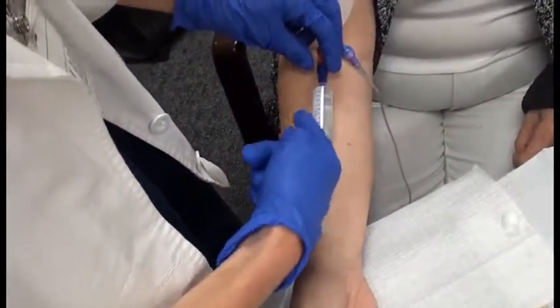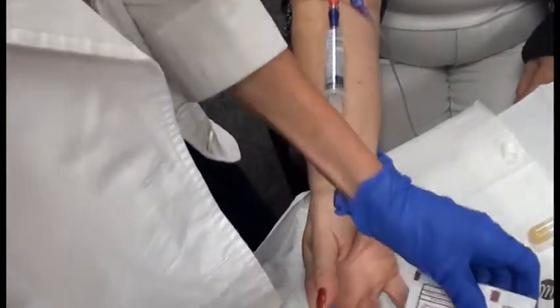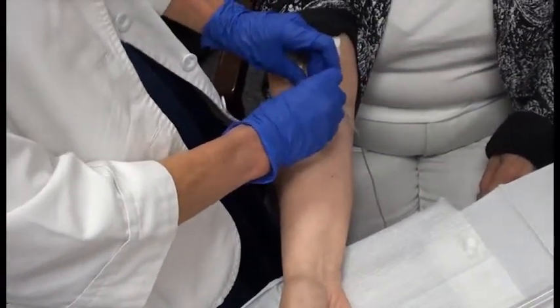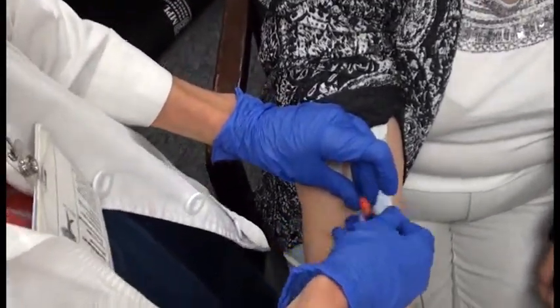which I'm going to pretend, because I don't want to get her all wet today. And then once that flush is finished, I can work on changing the cap. Cleanse the area here, the joint as it were, in case there's dust on there.